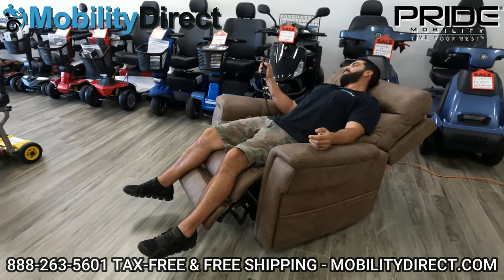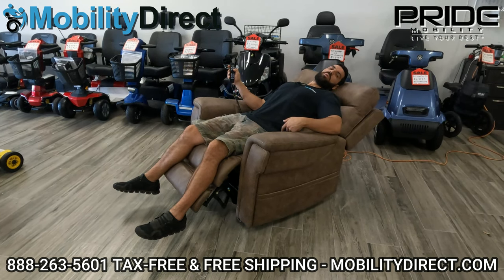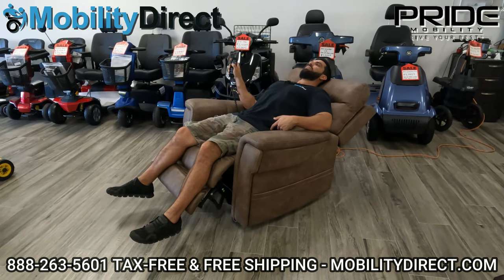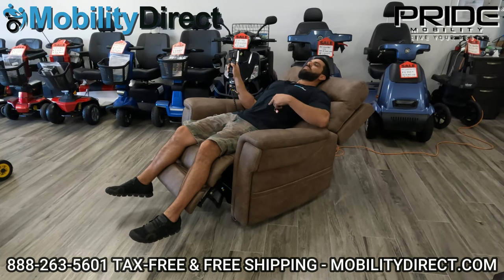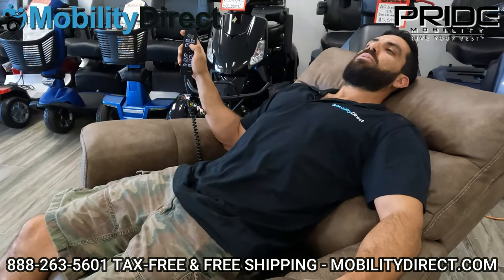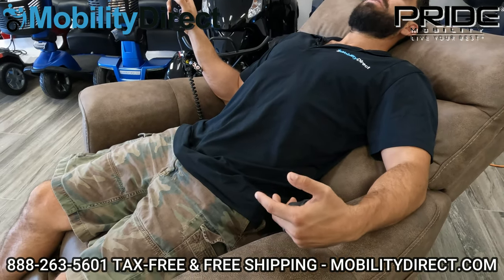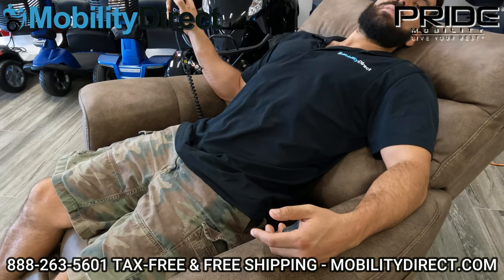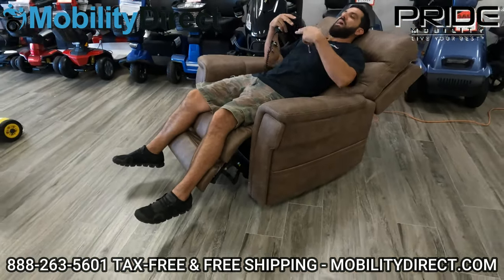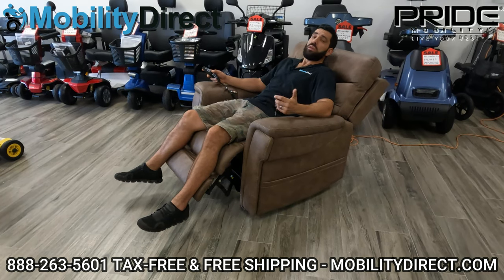Last but not least, we do have the lumbar support, which is basically an inflatable airbag right in the lower lumbar area that either inflates if you hold the right side lumbar button or deflates if you hold the left side lumbar button. You can see if you zoom in on my rib cage area — as I start to inflate it, my stomach's kind of being pushed outwards because that lumbar airbag is filling up. Eventually it builds a nice curve in your lower back, which can feel nice. I sometimes have lower back pain and having that lumbar airbag fully inflated keeps my back from bowing the wrong way, hyperextending it outwards, which is a comfortable position.